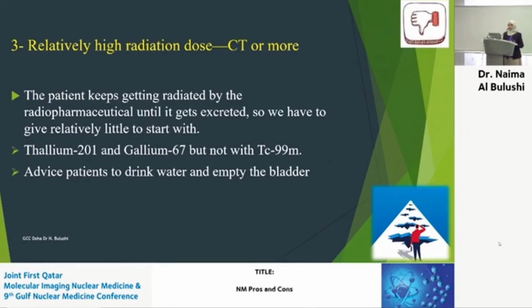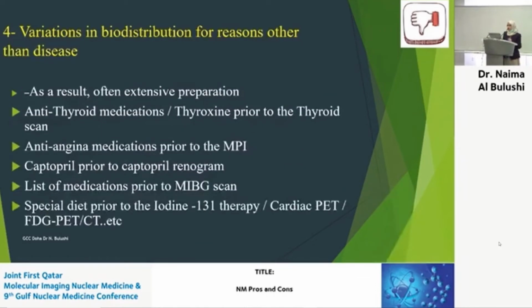And then also we know about the biophysiology, or distribution, of the radiotracers. So for example, for a bone scan, you advise the patient to drink water and empty their bladder. So you try to empty as much of the radiation as possible. For post-iodine, we advise them to have a lot of hydration. So we try to help the patient to get rid of the radioactivity as much as possible. But we can't say that, yes, nuclear medicine is higher radiation than CT in all imaging modalities, in all kinds of scans that we do, because having this as a comment is not really true.